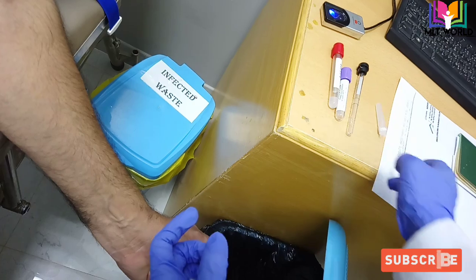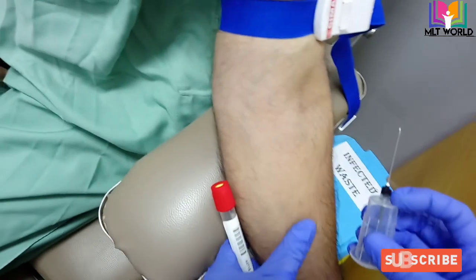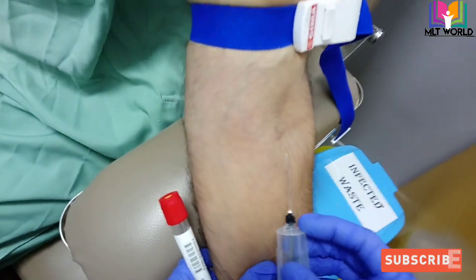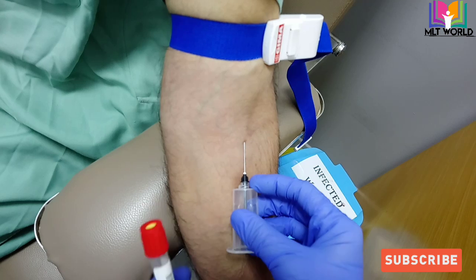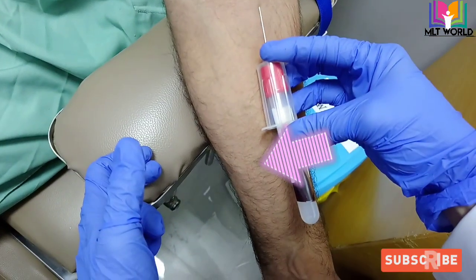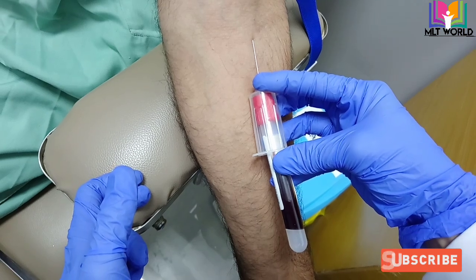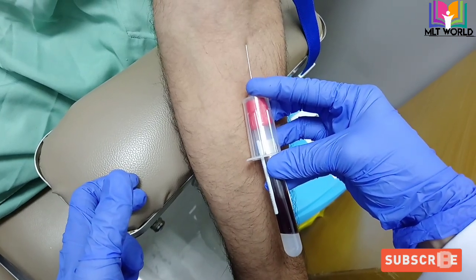Remove the cover of the vacutainer and take the first sample according to blood draw order — we will take the serum sample first. Insert the needle, and at the point where the arrow is showing, you have to maintain your pressure so that the needle does not come out.